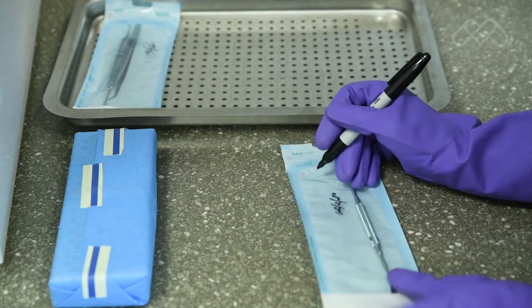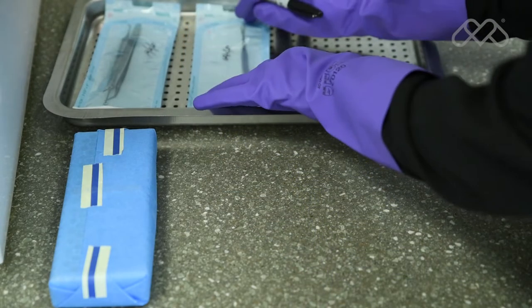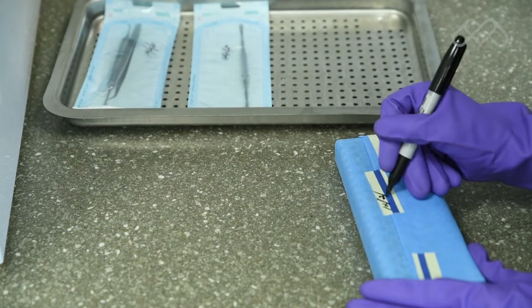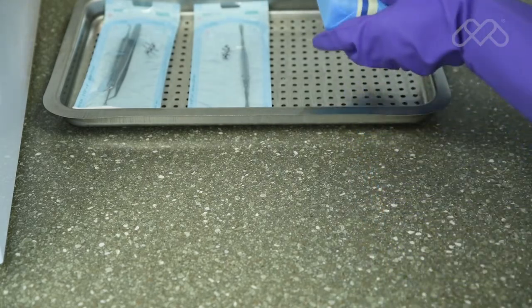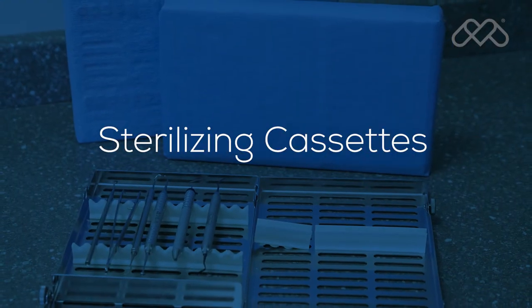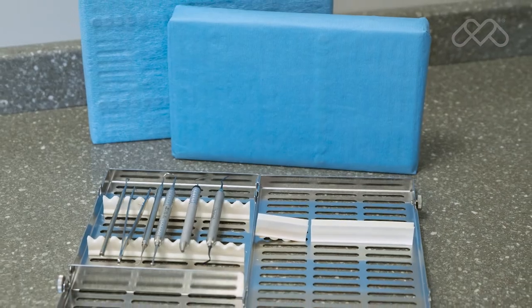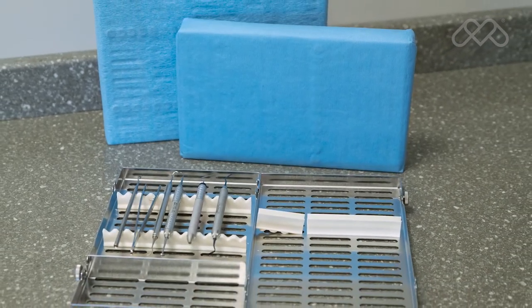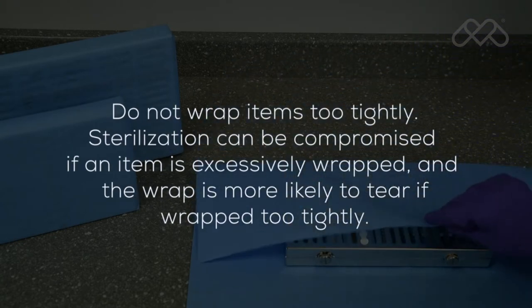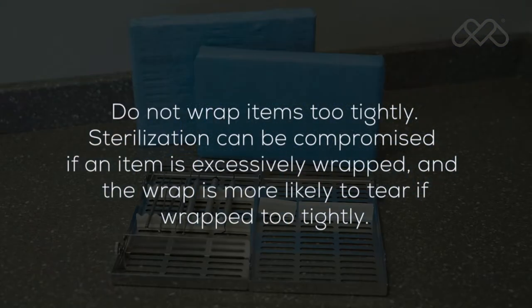On paper or plastic pouches only, mark on the plastic side of the pouch. On wrapped packs, mark the labeling information on the indicator tape or apply a separate label. When using cassettes in the M9 or M11, follow the cassette manufacturer's instructions for use. Do not wrap items too tightly. Sterilization can be compromised if an item is excessively wrapped, and the wrap is more likely to tear if wrapped too tightly.